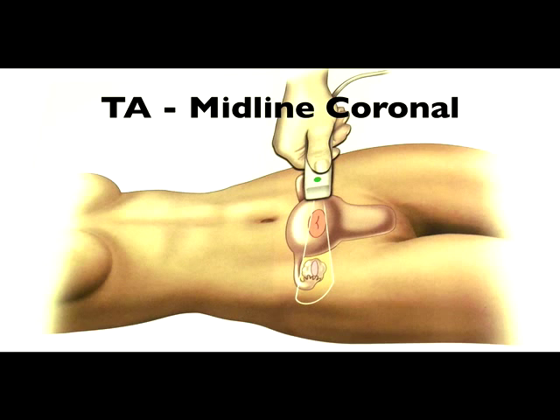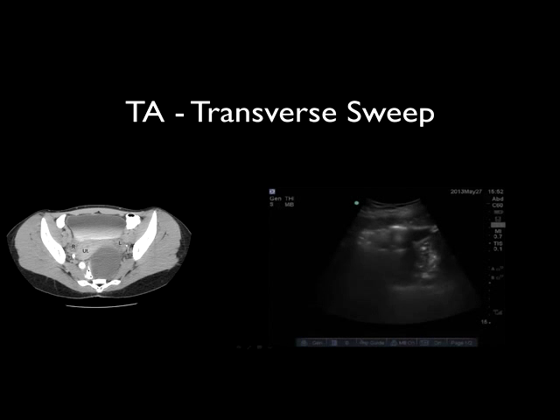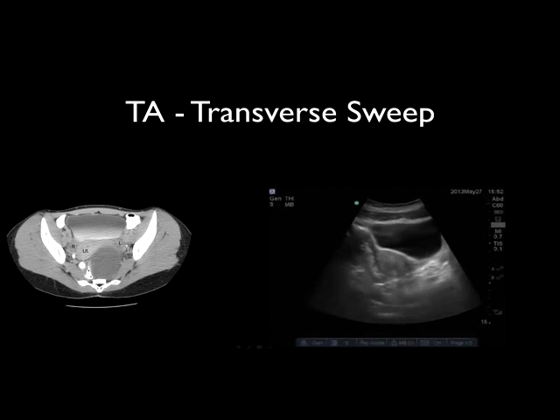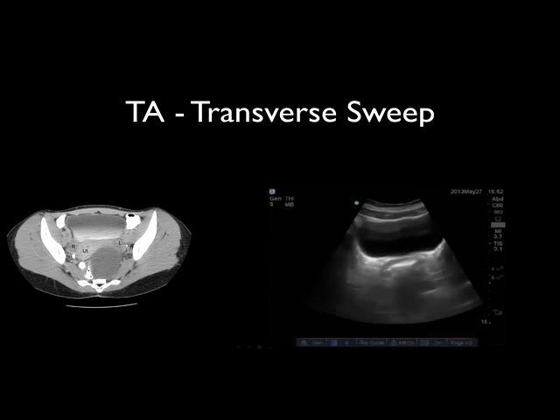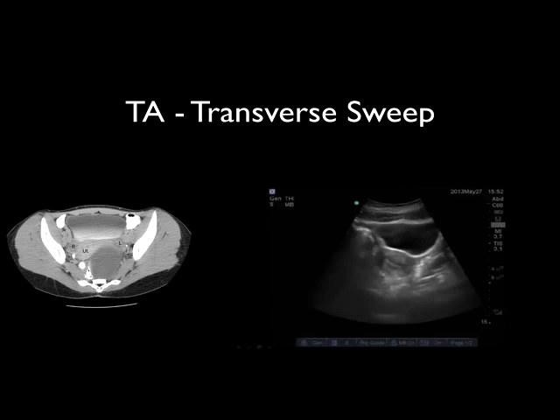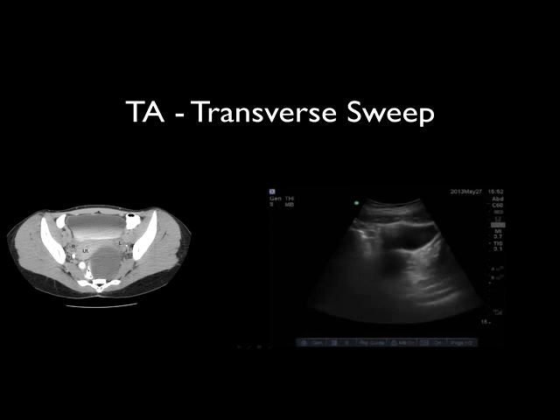Next, when doing our transabdominal scan we're going to do a midline or coronal image of the uterus. We're going to have the probe marker to the patient's right side and again the probe just superior to the pubic symphysis. On the right side we see an ultrasound image and on the left side we see a corresponding CT image. On our ultrasound image we start by visualizing the bladder, which is the anterior aspect of the patient. The probe marker corresponds to the patient's right side. Just posterior to the bladder is the uterus. You can identify the difference between the vaginal canal and the uterus: the vaginal canal has an oval appearance while the uterus has a more circular appearance.